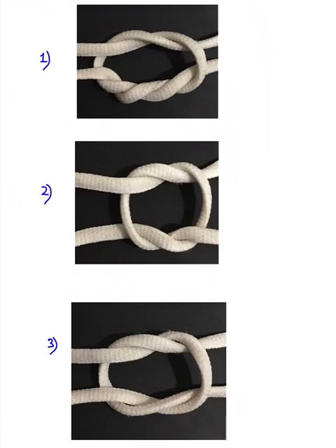Now try identifying this knot for me, guys. So this is a multiple loop, guys, in the end. Means this is a surgeon's knot. I think no more confusion, guys. Surgeon's knot. Now try to see this suture is up here, but it's coming down here. Means this is the granny knot.